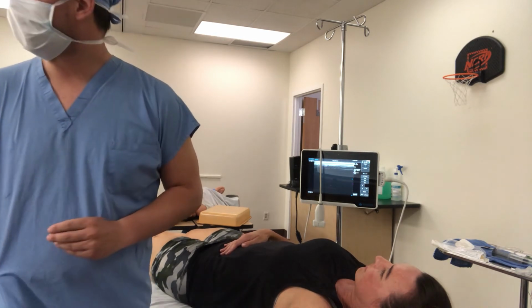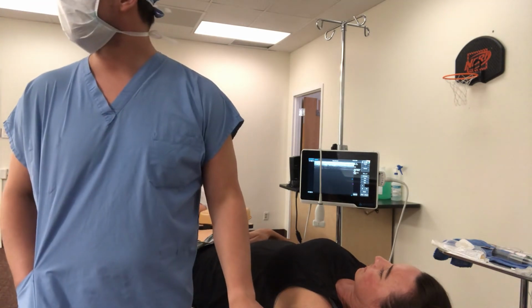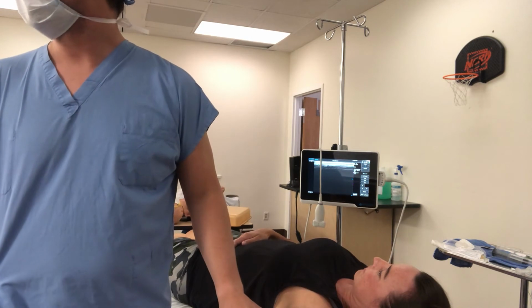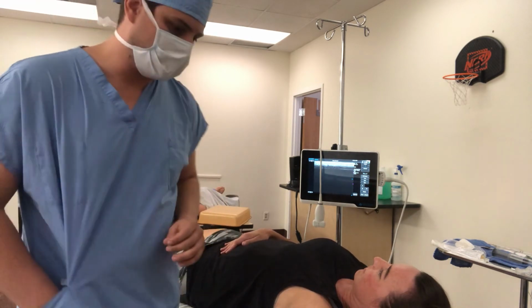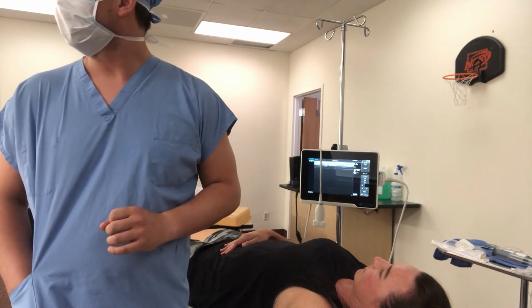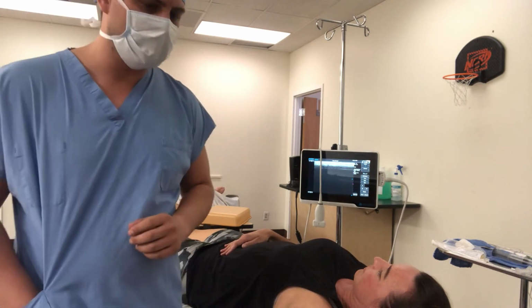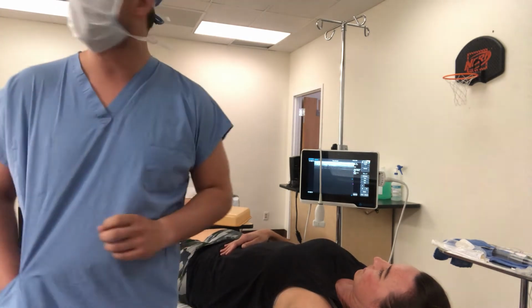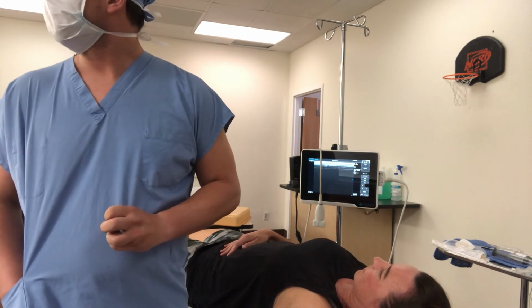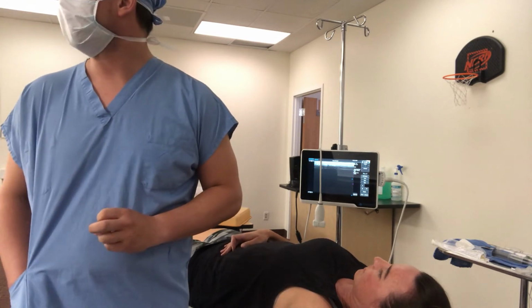For the axillary block, the indication is surgery below the elbow. She's going to have surgery on her wrist. There is also some increased risk for LAST, and we're going to decrease that risk by aspirating before we inject and using ultrasound guidance as well as a peripheral nerve stimulator. This is a shallow, easy to access nerve, so it should be a good axillary block.